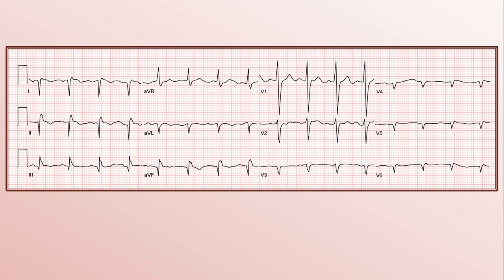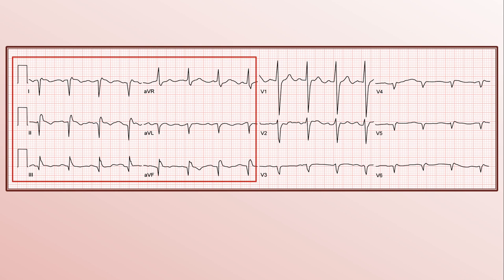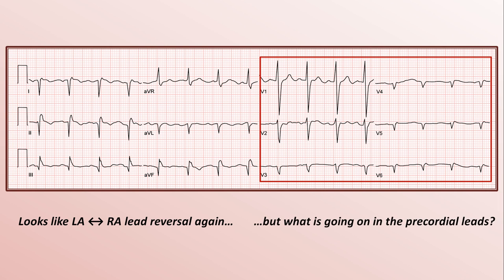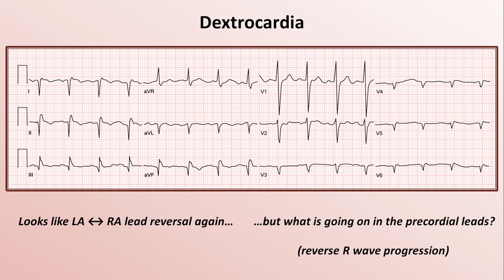We are halfway through at diagnosis number 6: a patient with no cardiac history presenting to the pre-op clinic prior to an elective surgical procedure. Examining just the limb leads, this might look like another case of left arm–right arm lead reversal with a right axis deviation, in this case an axis of about negative 180. But what is going on in the precordial leads? This patient has reverse R-wave progression, in which the R-waves get progressively smaller moving from V1 to V2, and by V3 the R-waves are essentially gone altogether. This is a patient with dextrocardia, in which due to an abnormality in the earliest stages of embryonic development, their heart is literally located on the opposite side of the thorax as a mirror image of the normal heart.